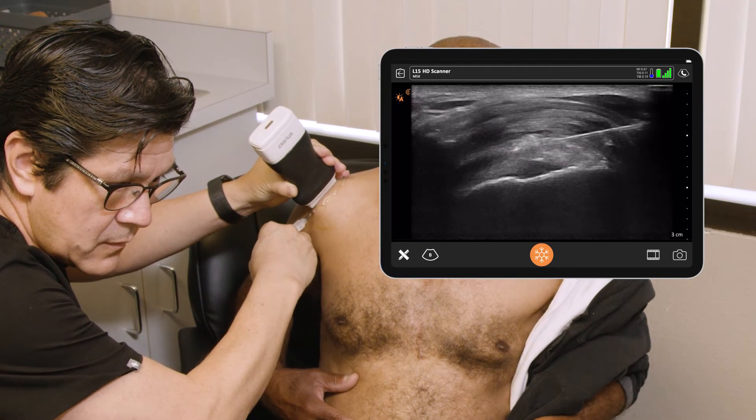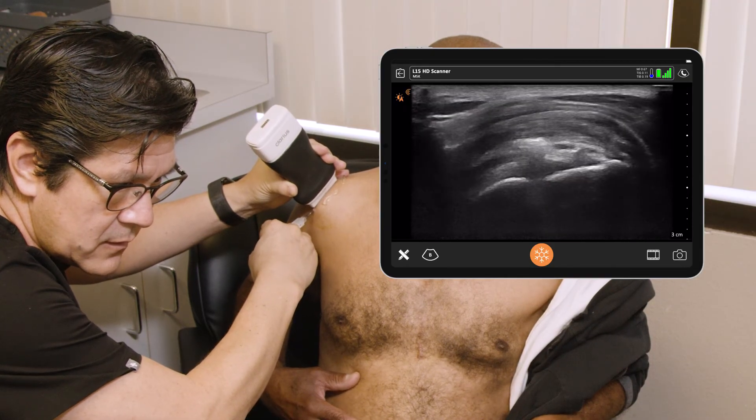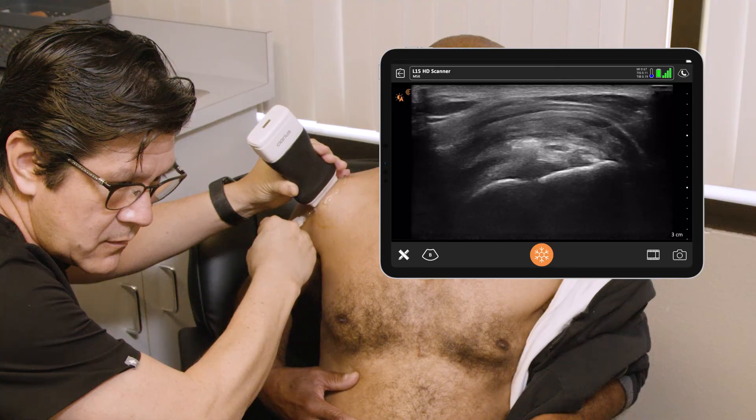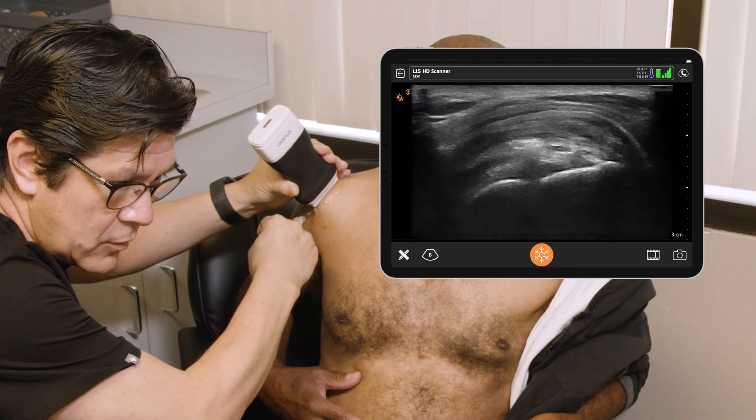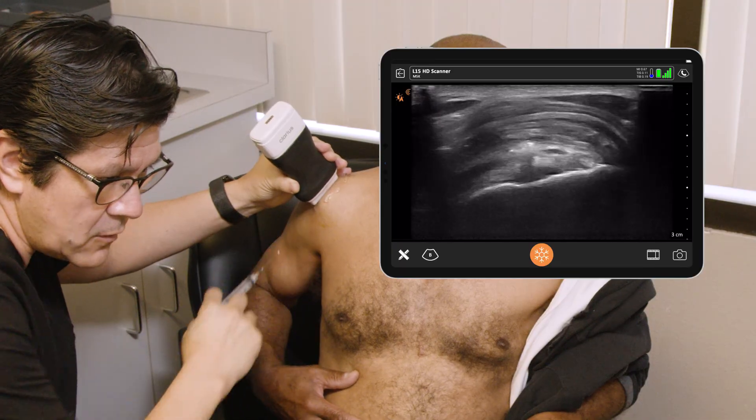I can feel it. Almost done. And we're finished — all done.